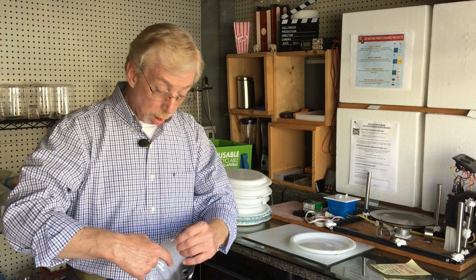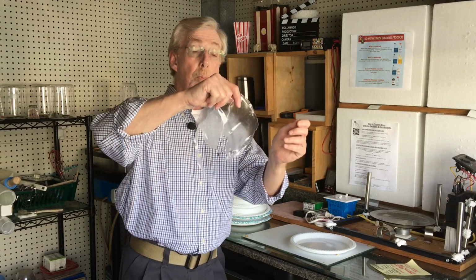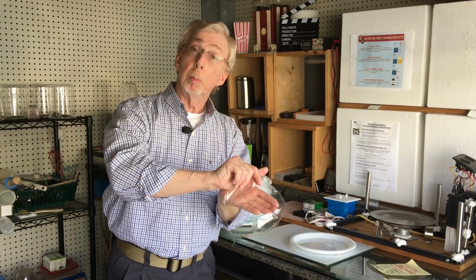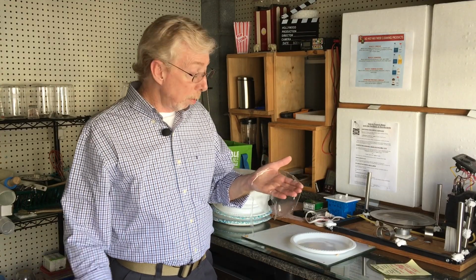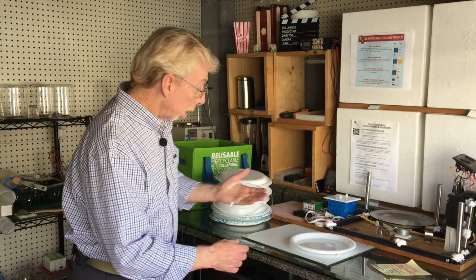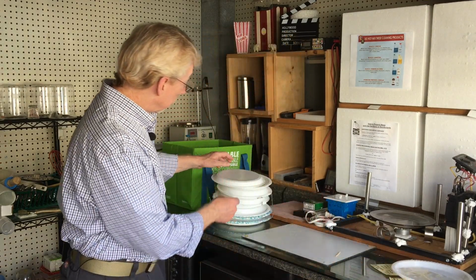And I'm in a hurry, so I peeled it off and I tore some, just to show you. Near optical clarity, I still have some trouble with bubbles, and we have to get rid of more of the bubbles. And you can certainly do that on your own. But I'm going to show you what I've got here.